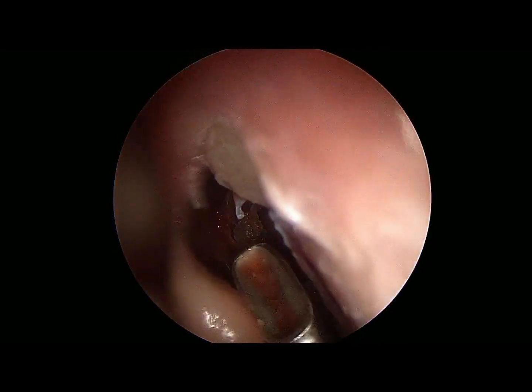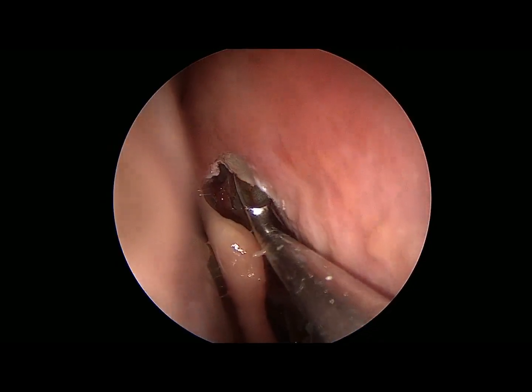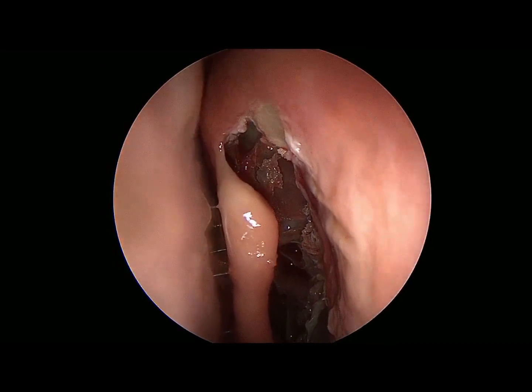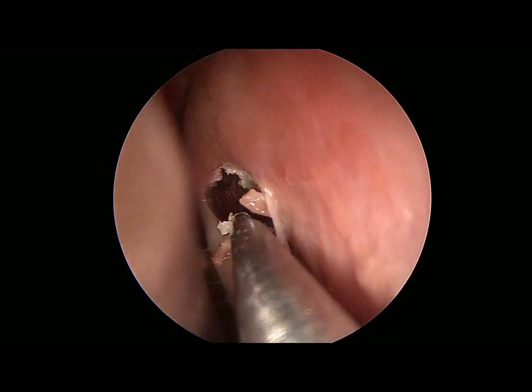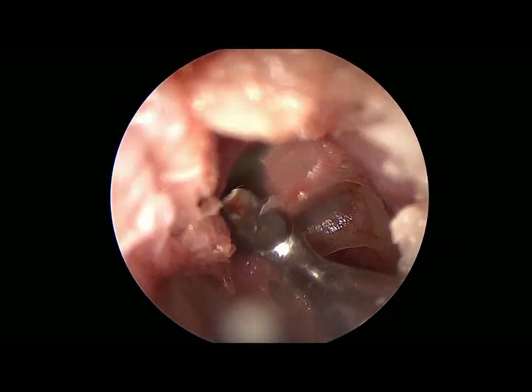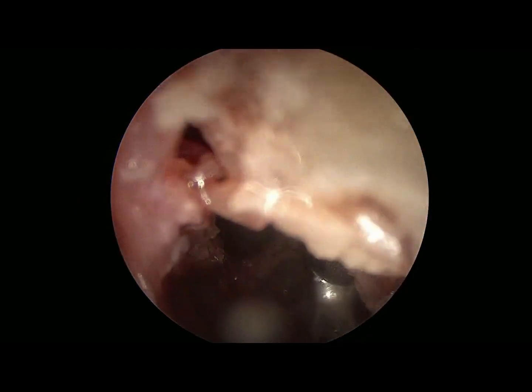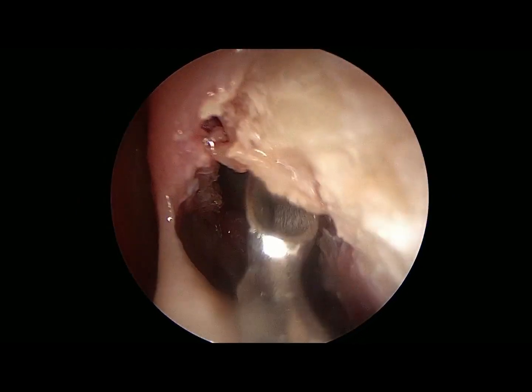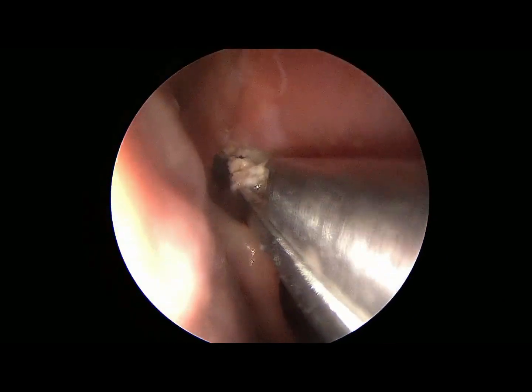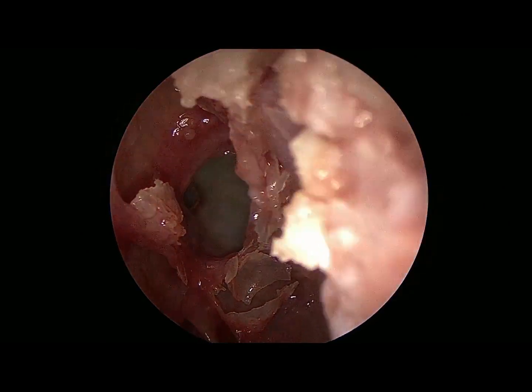And now I am removing part of the frontal process of the maxilla, or the anterior wall of the agger cell. See, I am using the Kerrison punch here to remove the tough bone, that is the frontal process of the maxilla. Now I am taking the curette and removing the last bit of bone, the posterior wall of the agger, and now you are able to see the frontal sinus very clearly once you do this step.